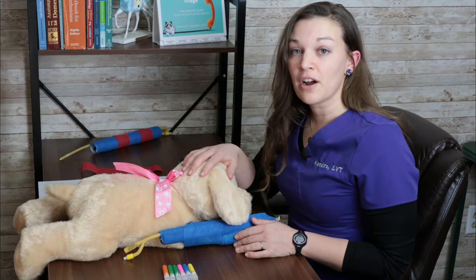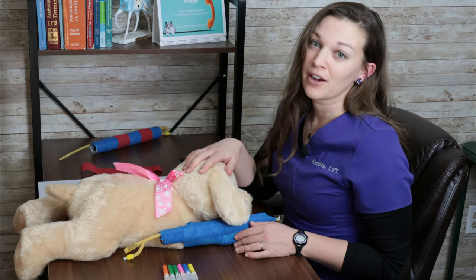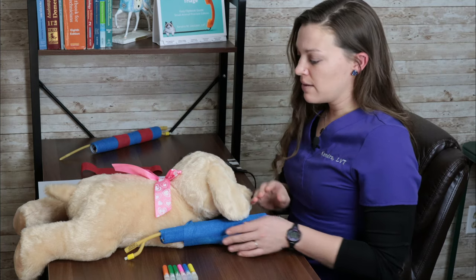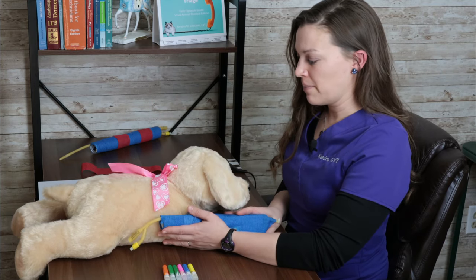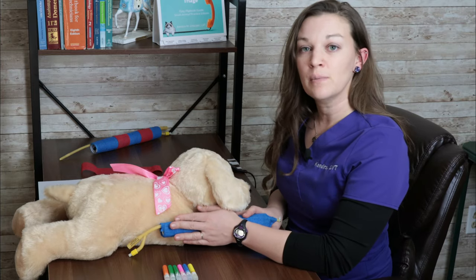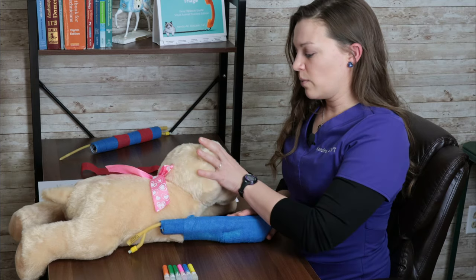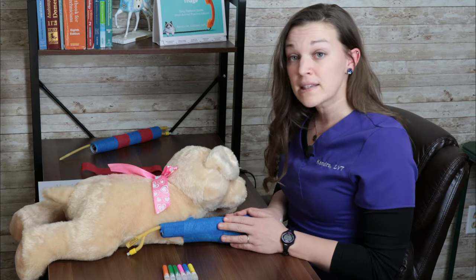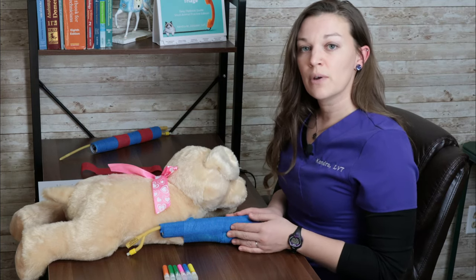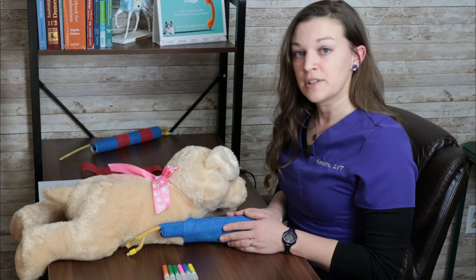First, we're going to start on a routine IV catheter placement with patient Penelope here. The vein that we're working with today, I have a dummy rigged up on Penelope, and so we're going to mimic a cephalic vein placement. The joint that we're looking to reference when we're deciding the appropriate place to place this catheter is the carpus. So we want to start just above or proximal to the carpus if we're using a front leg on a patient.